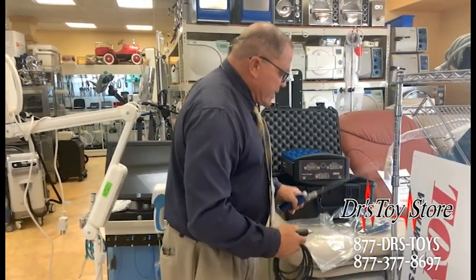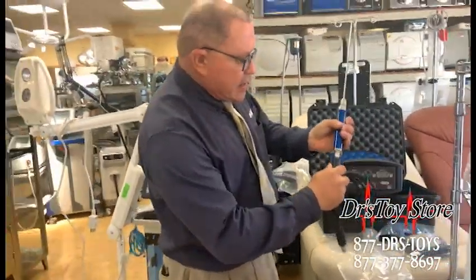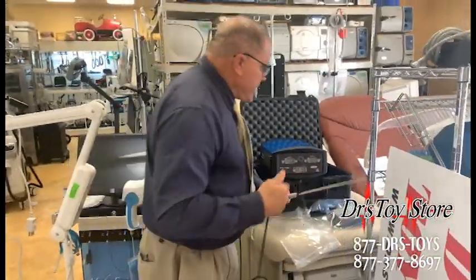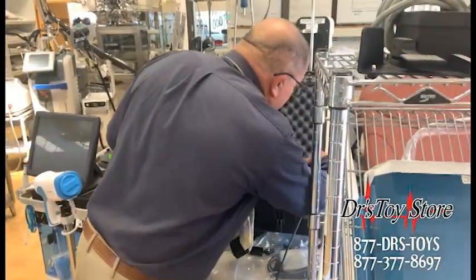So basically you just take one of these and put it right in — red to red, click. And you take this other end, it goes right in the side, click — red to red.